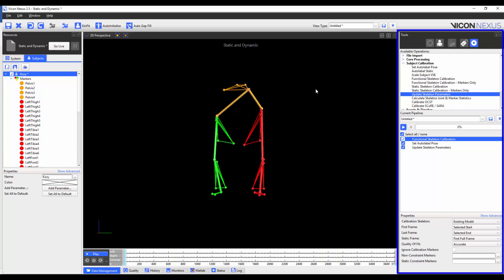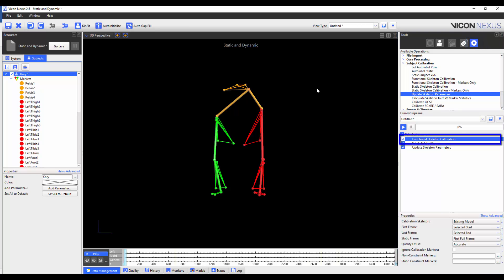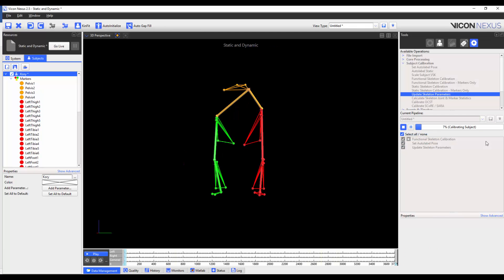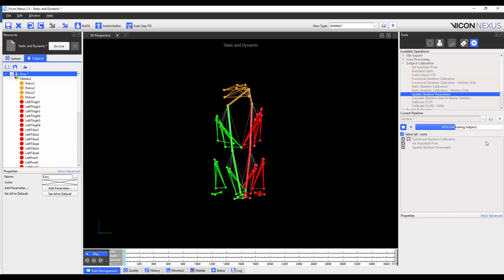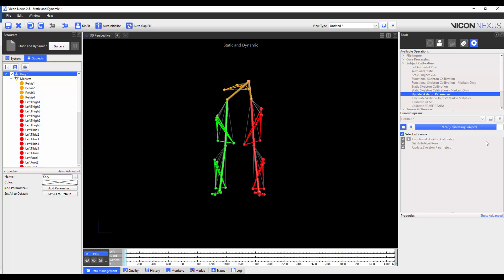Now that I'm happy that my trial is properly labelled, I'm going to go to the Tools pane, Pipelines tab, and I'm going to run the Functional Skeleton Calibration Pipeline operation. You can see that Nexus has calculated the relevant joint and marker statistics necessary to autolabel this subject. We will be adding this to the template for future subjects, though its performance is optimised if the joints it shows after calibration match closely to the body.